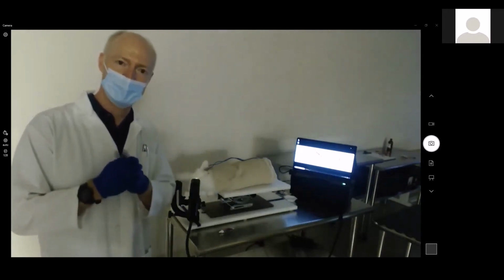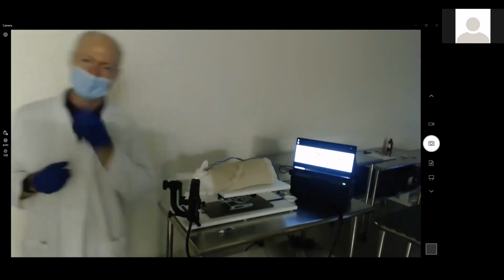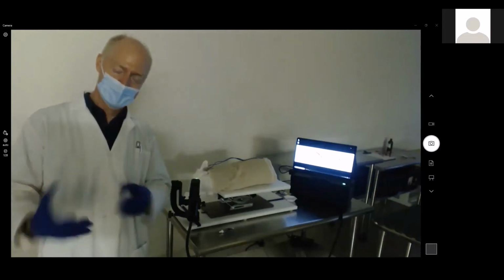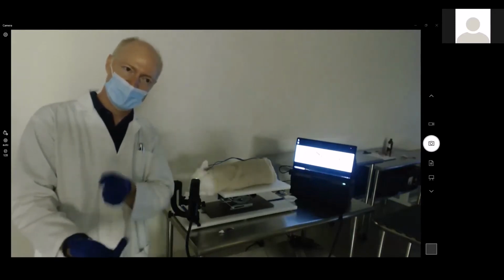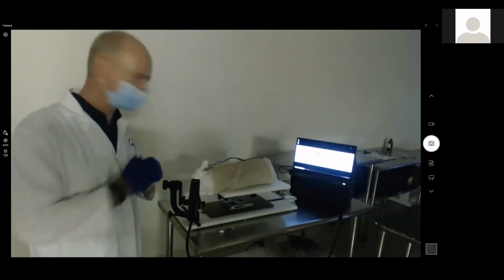You can capture those images very, very quickly. The challenge is going to be trying to capture the OCT in the retina, because now you have to deal with a depth component, and now you have to be literally within microns of the right distance away to get a good image, as you've seen when we had the static rabbit.